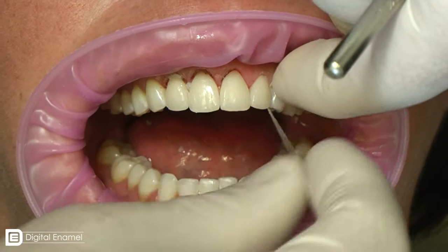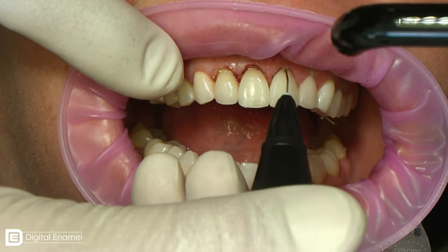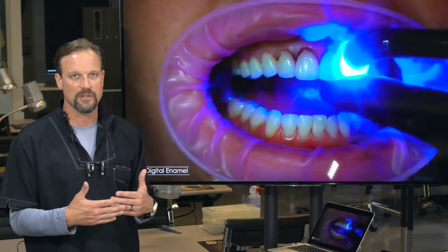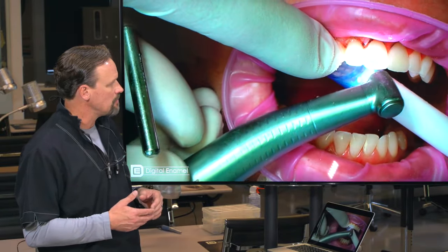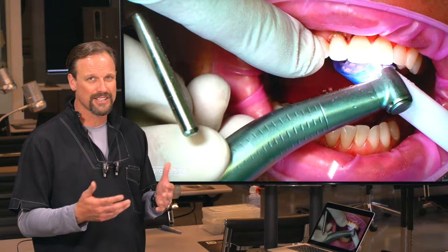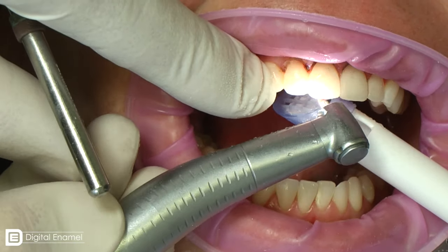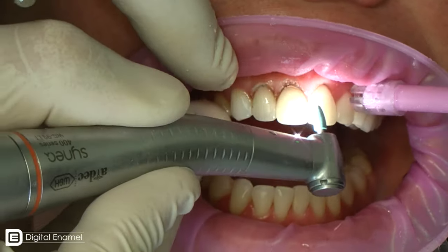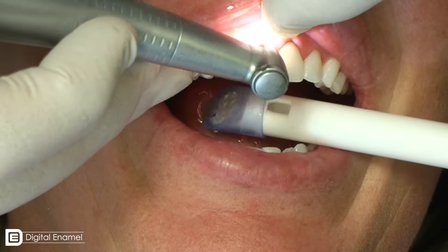The key thing to any bonding system is really covering the oxygen-inhibited layer. Brown margins, in my opinion, typically occur because the oxygen-inhibited layer isn't totally covered. So we'll finalize the cure and then get that polished back. I only use a few instruments to clean up — brownie points work extremely well. Greenie points are neat because you can use them as a tight point that gets in there without scratching the ceramic or tooth structure. They're very gentle as long as there's water and not a lot of heat. Then we finish with maybe a flame-finishing bur.